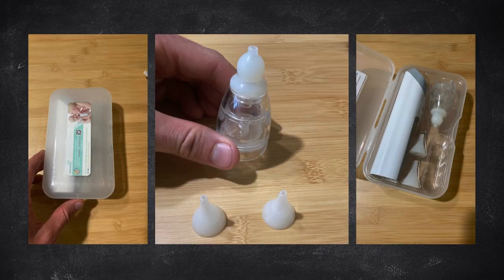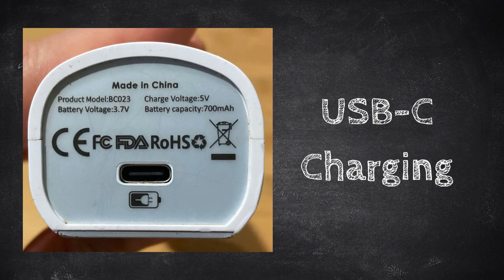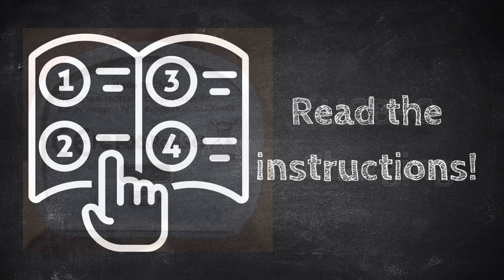This snot sucker comes with three silicone tips, but so far we've only needed to use the small one. It comes with a USB-C charging adapter and detailed instructions.